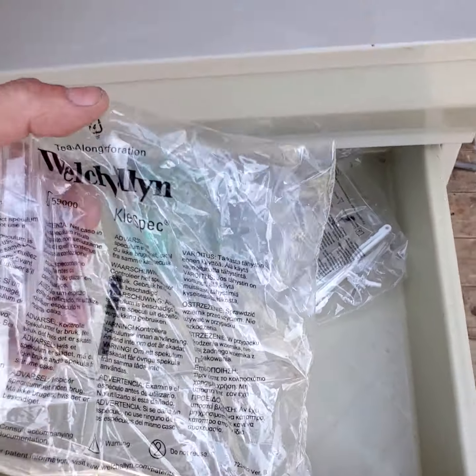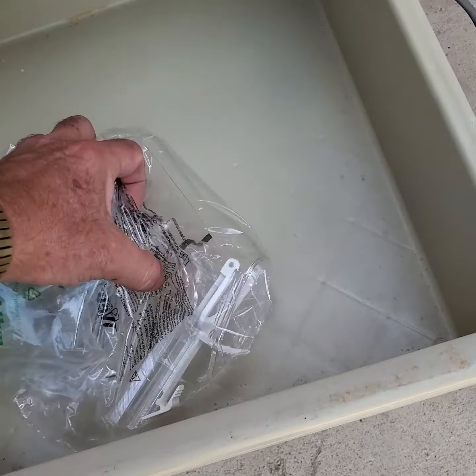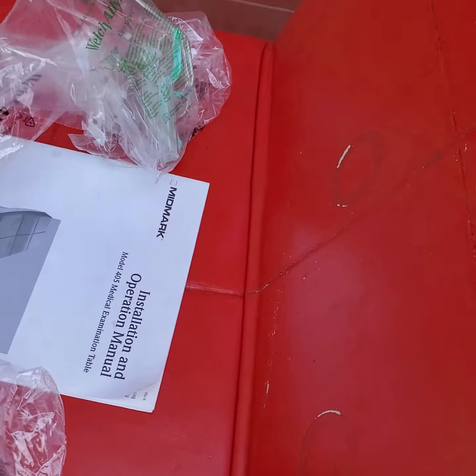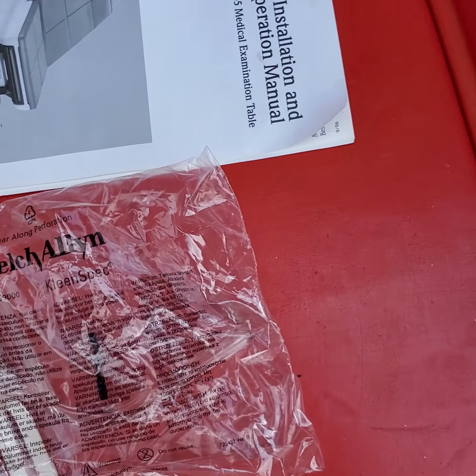By the way, it comes with four of these Welch Allyn Vaginal Speculum. They're model 901-071. They're all sealed. So there are four of these.